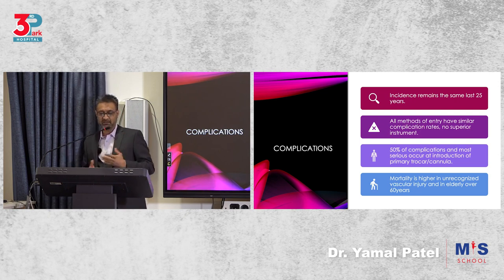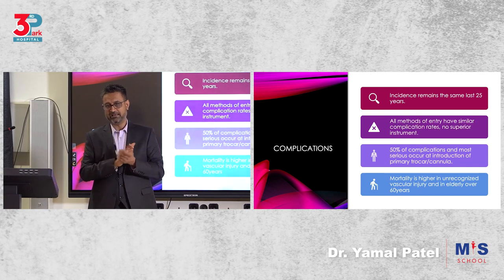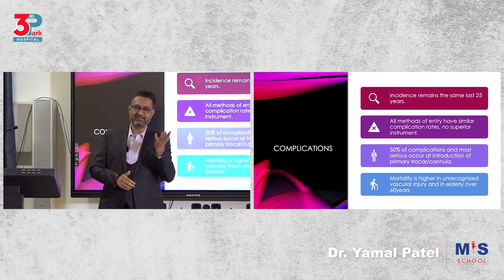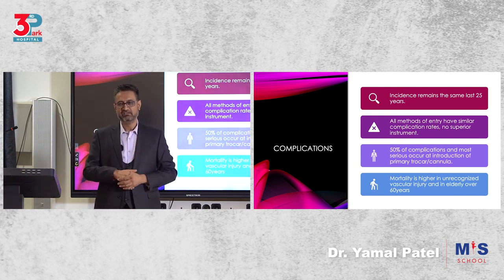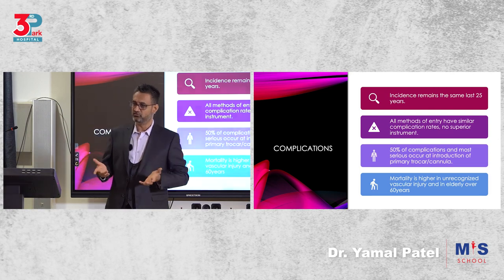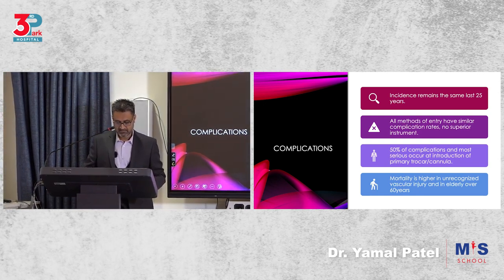So this has remained similar over the last 25 years, and I would say all methods of entry are equal. So it's more of what you develop and what you specialize in. I am now, as I told you, direct trocar entry. I still have some of my mentees who are comfortable with the Veress entry. I know our surgeons in this country are very comfortable with the open Hasson's technique. So it's what you get used to. But there is none that is superior over the other in terms of complications or risk factors.